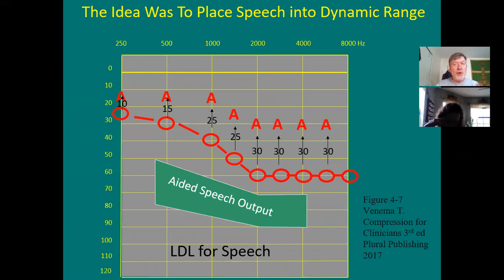And they are all children of that original half gain. So Berger, the A's might be higher at 2,000 and 3,000 hertz. POGO, the A's would be the same, but probably less for the lower frequencies. Libby, all the A's would probably just be 1/3 above the thresholds.